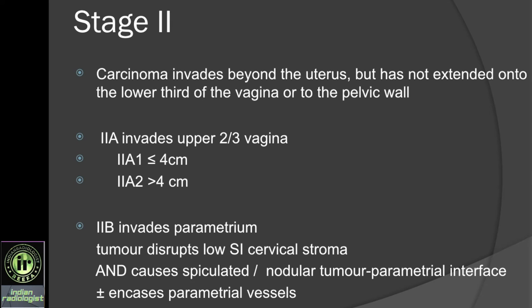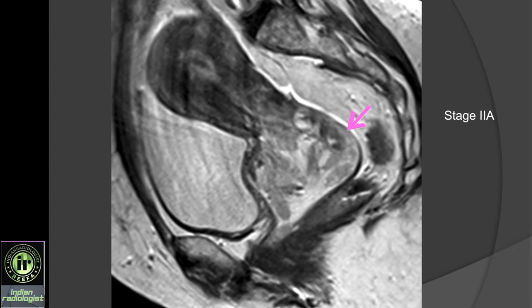Moving on to stage 2 cancers. These extend beyond the uterus but not to the lower third of vagina or the pelvic side wall. Stage 2a involves the upper two-thirds of vagina, with subgroups based on size. Stage 2b extends into the parametrium, in which you lose the low signal rim of the cervical stroma, causing an irregular and nodular outline at the tumor-parametrium interface, and it might encase the parametrial vessels. Here we have a tumor in the cervix extending into the upper vagina — involving the posterior vaginal fornix and anterior vaginal fornix — so this is stage 2a.